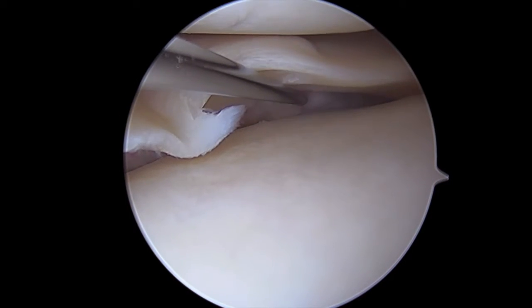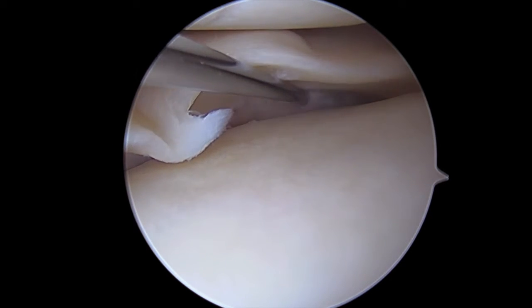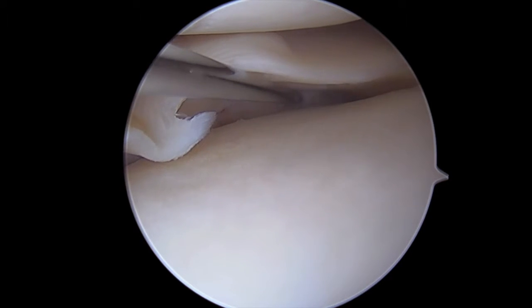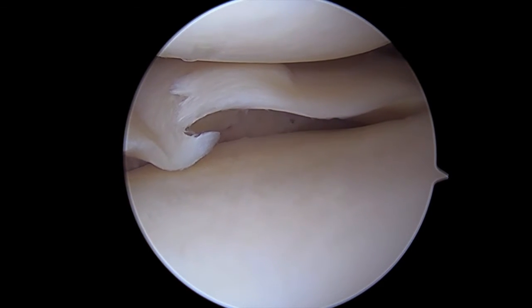To give us room, we've trephinated the medial collateral ligament. As I'm probing, I can see that I actually need to go a little bit further here, so we continue to stress the knee until I can get the meniscal compartment opened up adequately so I can place my sutures.